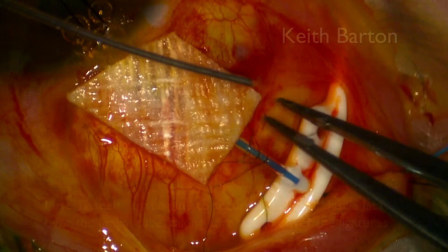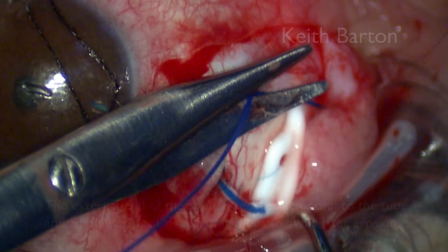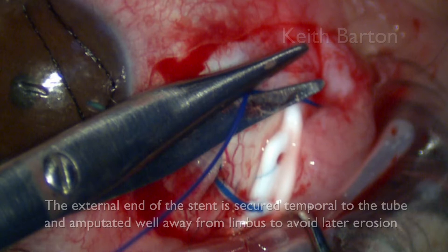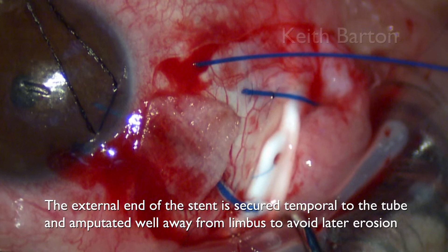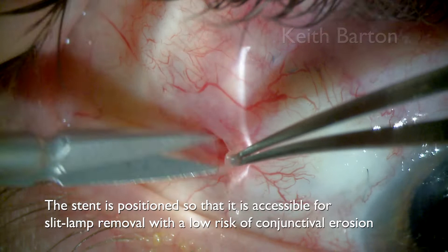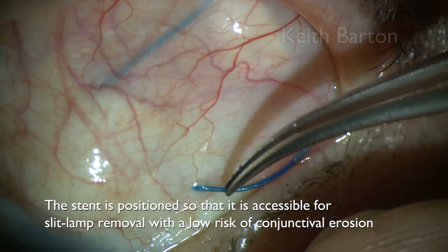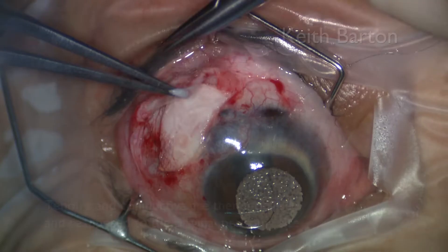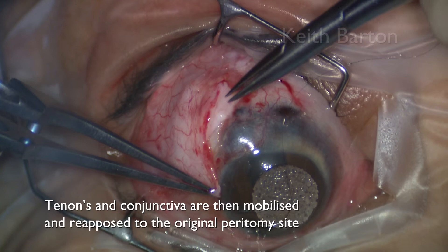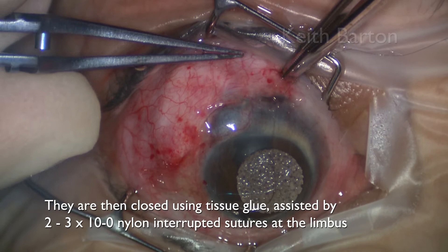I also use tissue glue to secure Tutoplast fascia latae over the limbal tube, taking care not to cover the ligatures. The external end of the stent is secured temporal to the tube and amputated well away from the limbus to avoid later erosion through conjunctiva. The stent is positioned so that it is accessible for slit lamp removal with a low risk of conjunctival erosion. Tenon's and conjunctiva are then mobilised and re-apposed to the original peritomy site, then closed using tissue glue assisted by 2-3 10-0 nylon interrupted sutures at the limbus.